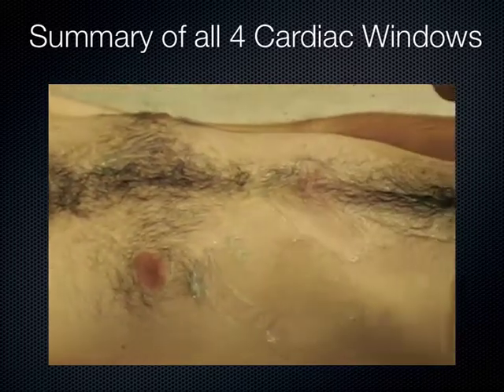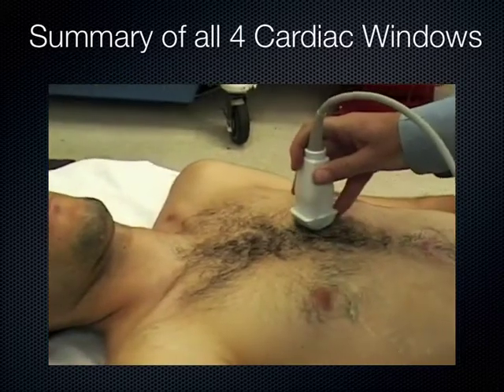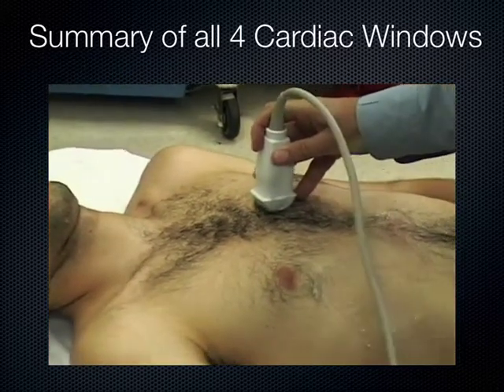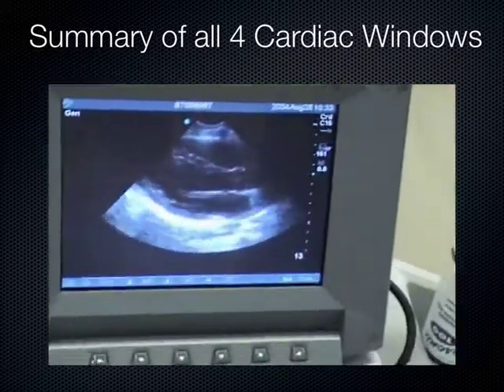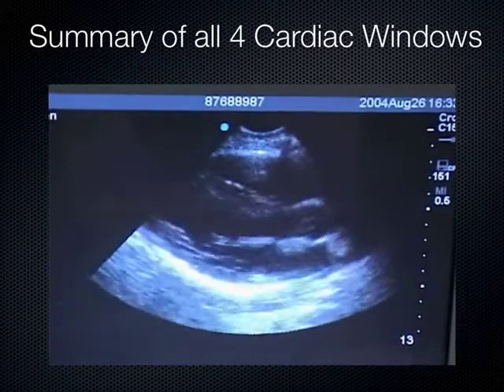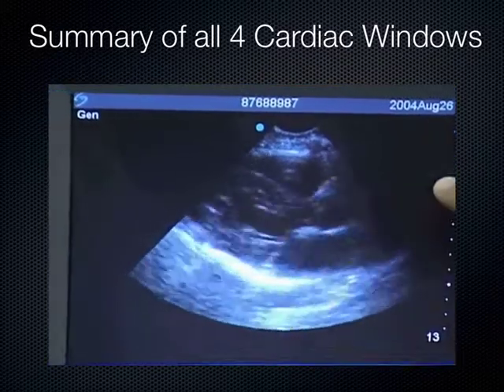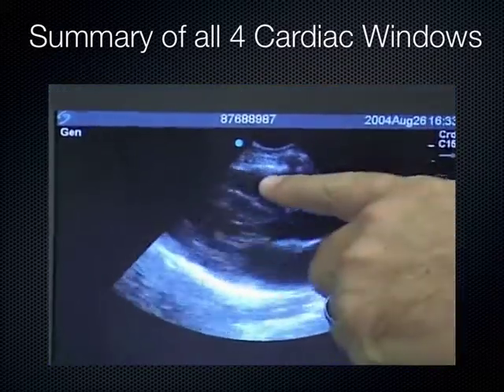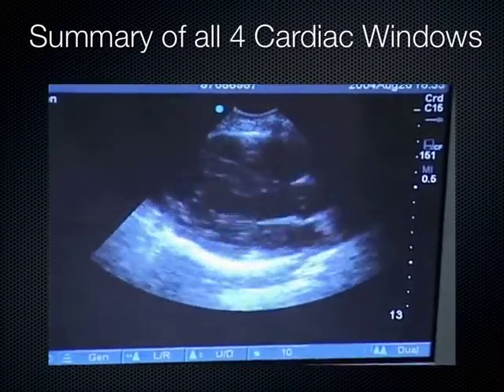Now, there's another view called the parasternal long, where you take that indicator towards the patient's left elbow, and now we can see the heart on the screen. It looks pretty small. We're going to need to decrease the depth to have it take up most of the screen. Left atrium, left ventricle, aortic valve, aortic outflow tract, this way, right ventricle. Okay? Now that's a parasternal long view.